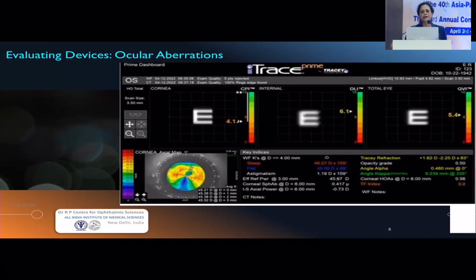Looking at the ocular aberrations is important to look at the multifocality of the cornea which you are going to be treating with a toric IOL implantation. So those corneas whose multifocality, whose Q values have been altered, either they have higher quotients of irregular astigmatism by something like ectasias, keratoconus, or there is a post refractive surgery component.